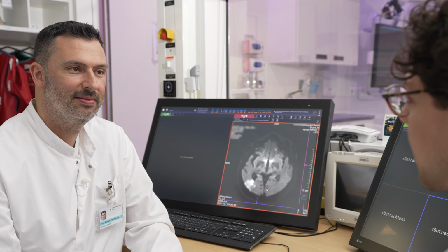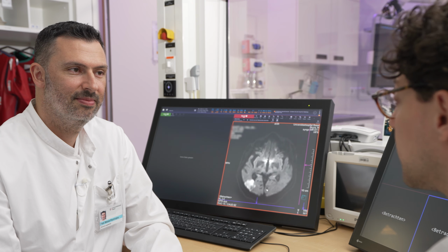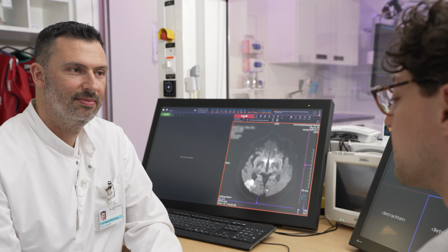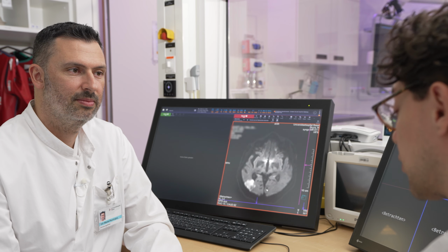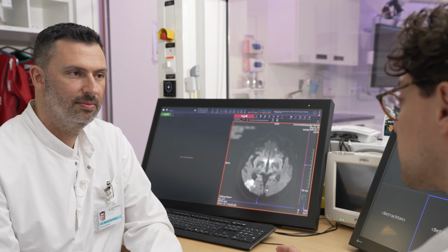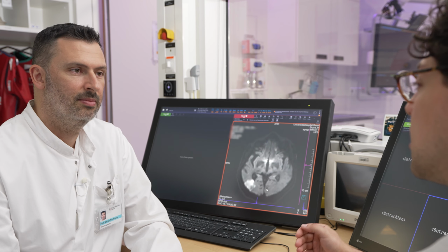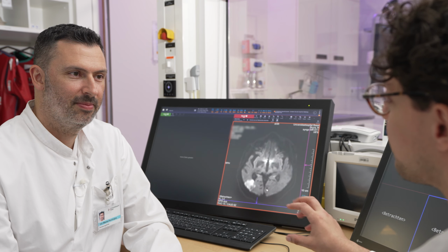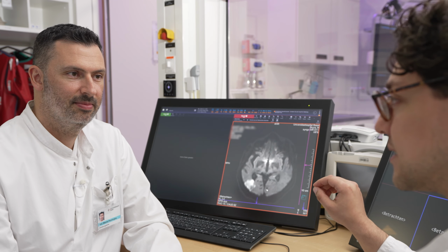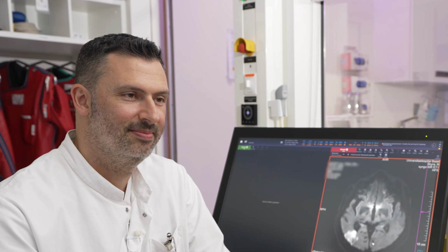To me, it was very interesting how, although we didn't have any signs of an acute stroke in the native CT or in the CTA, by going back to the perfusion, and of course with our anatomical knowledge, we could not find the occlusion, but find where the occluded vessel should be, and then give that information to our neurointerventionalist colleague. And if you know where the vessel should be, then you can go very dedicatedly and search a bit, and the vessel will be there if you have the clinic and the perfusion deficit.